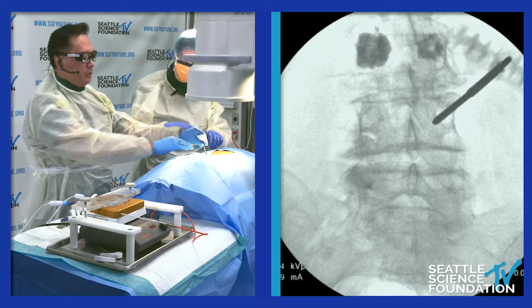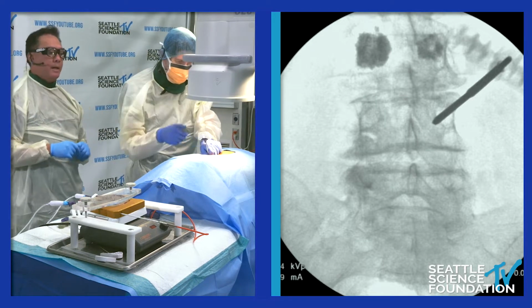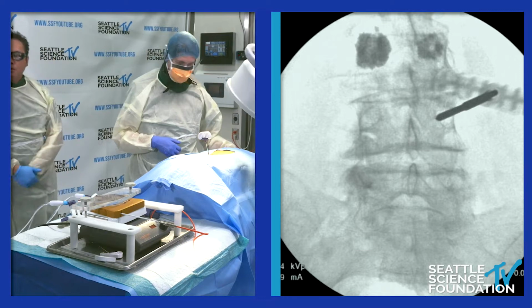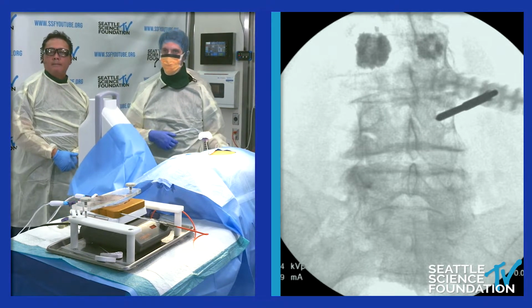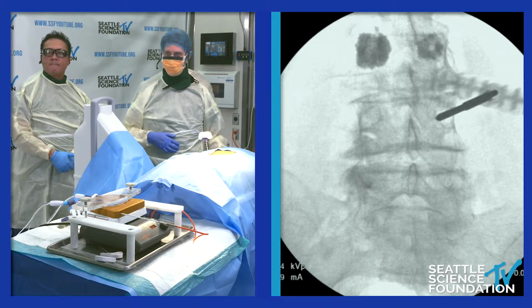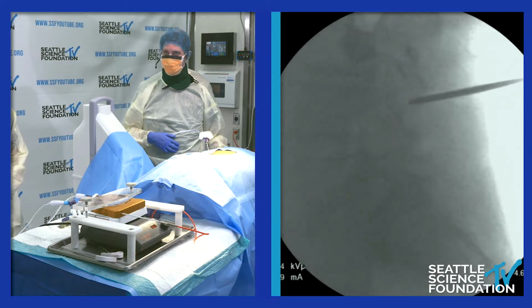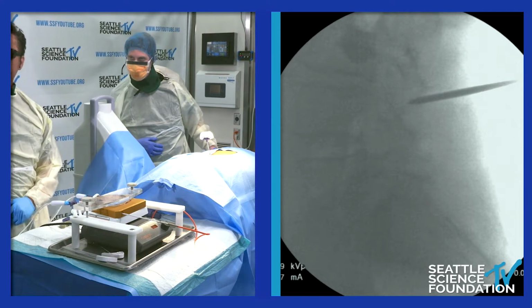I'll back it up a little bit. We'd probably want to make sure we're taking a lateral before we're crossing the medial pedicle line there. As you can see, Glen is extremely meticulous, and you can't be off at all on an AP view, otherwise he'll make you redo it. Get a lateral there. So we're pretty far outside.